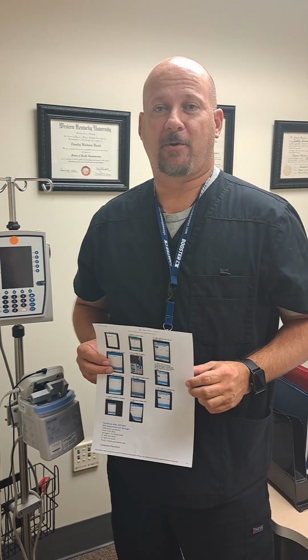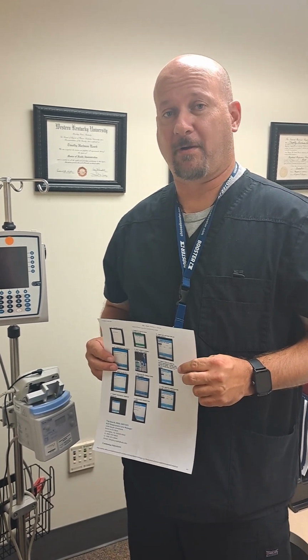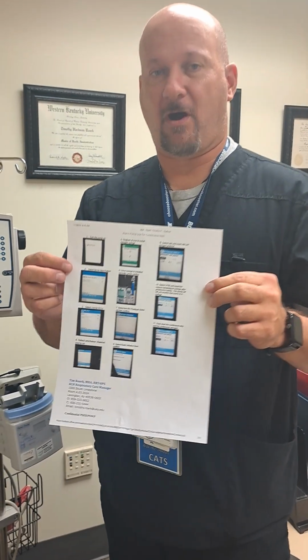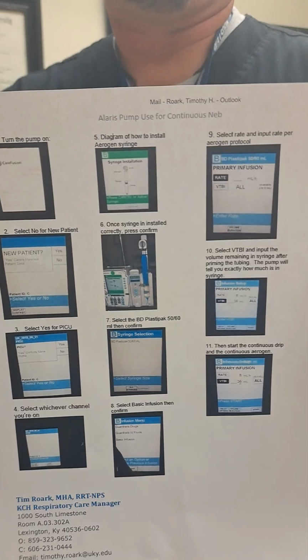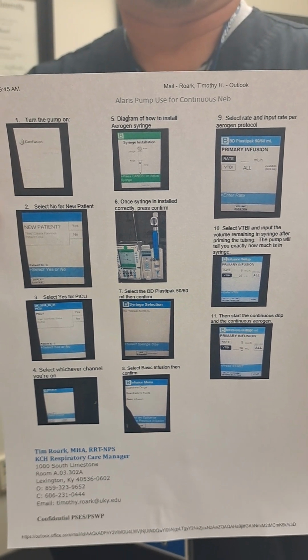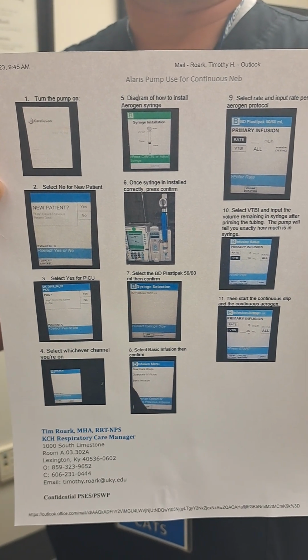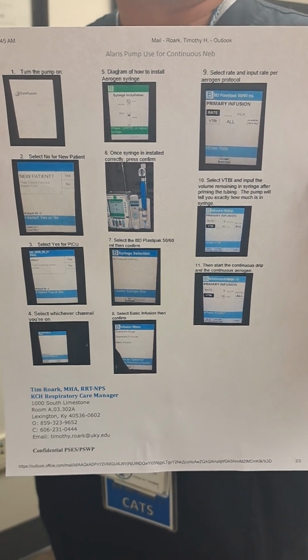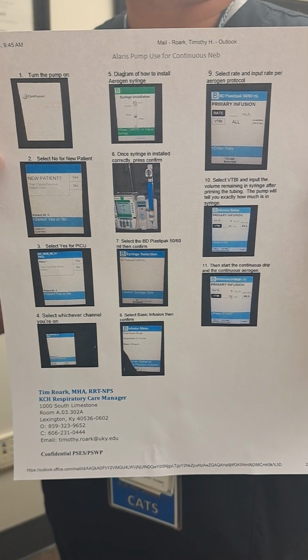Hello everybody, the purpose of this video is to go over the Alaris pump and its use with continuous albuterol. In everyone's email you will have all the steps that you need to use the Alaris pump while doing the continuous albuterol treatment. Feel free to print this off and take it to bedside with you. This is what I do every time I'm setting one up just to make sure I don't miss a step.